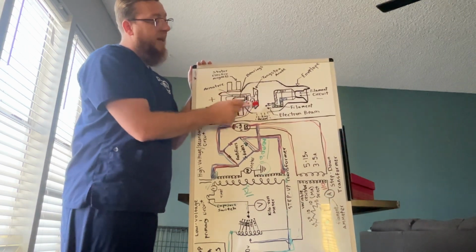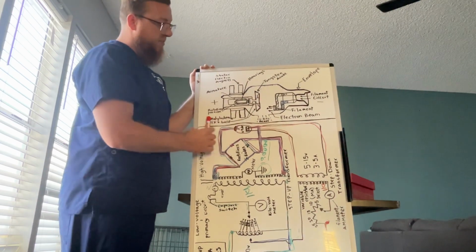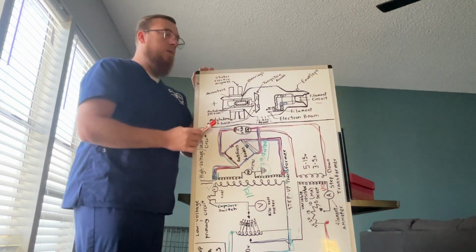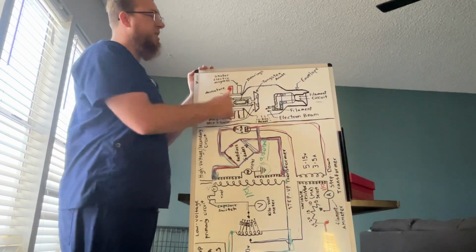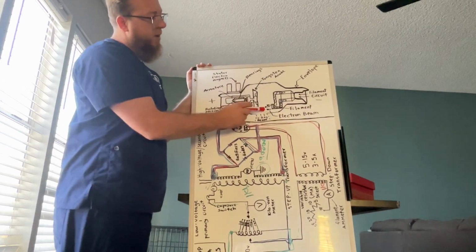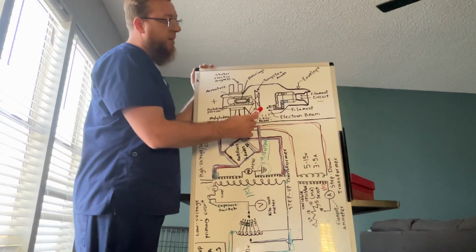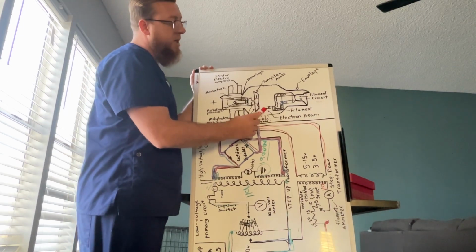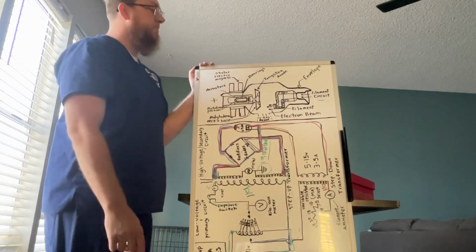This is our anode right here, this whole thing is our anode. This is our anode plate that's made of tungsten. This section of the anode is made of molybdenum, which is a steel capable of high heat, but not as much as tungsten. And our plate is going to be made with a 12-degree angle. The reason for that is it's the best degree that we can get to try to get the most electrons going out of our X-ray beam.